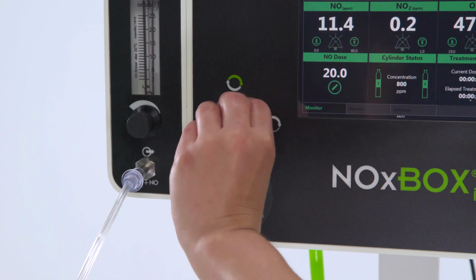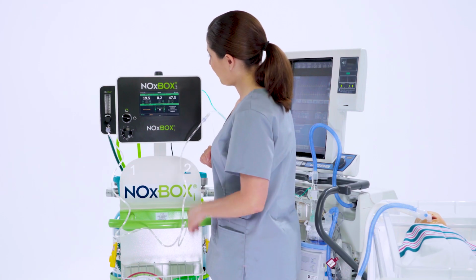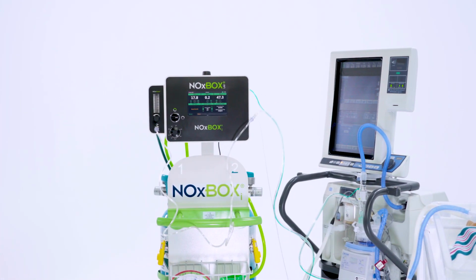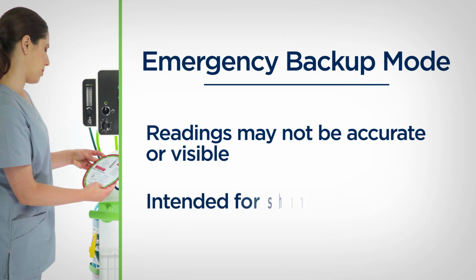Rotate the mode selection valve to the manual override mode for bagging, emergency backup, or neopuff circuit use. Note, monitored readings in emergency backup mode may not be accurate or visible. The emergency backup mode is intended for short-term use only while the unit is replaced or the power issue is resolved.